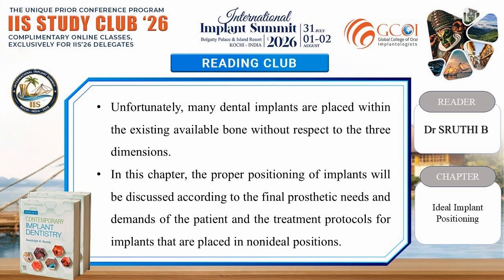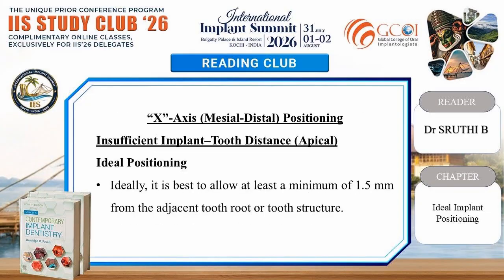Unfortunately, many dental implants are placed within the existing available bone without respect to the three dimensions. In this chapter, the proper positioning of implants will be discussed according to the final prosthetic needs and demands of the patient, and the treatment protocols for implants that are placed in non-ideal positions.